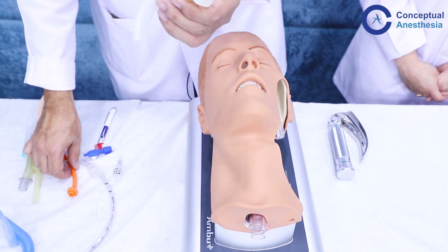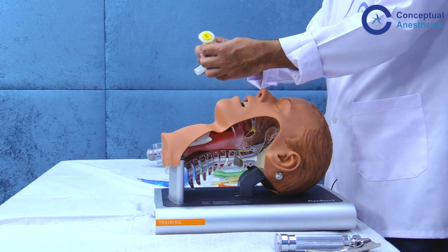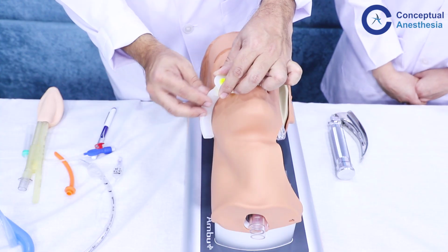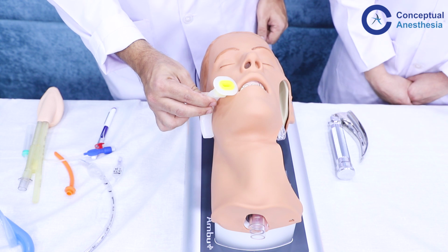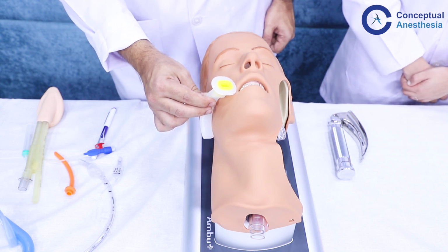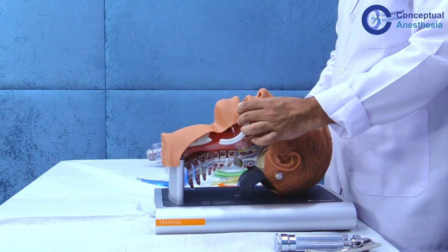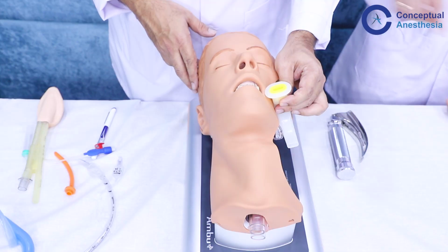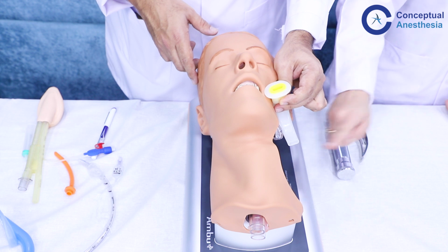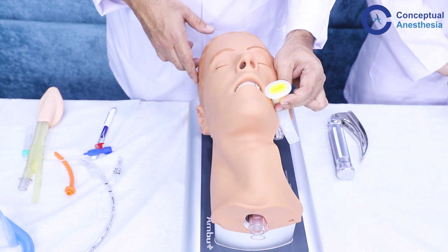So here we have the Guedel's oropharyngeal airway. We will show you how to gauge what is the correct size of oropharyngeal airway to be used in the patient. So place the flange of the airway at the angle of the mouth and place the tip of the airway at the tragus of the ear. So the ideal way to gauge the size of an oropharyngeal airway is the flange should be at the angle of the mouth and the tip should be at the angle of the mandible. If this fits properly, this means it is the ideal oropharyngeal airway.